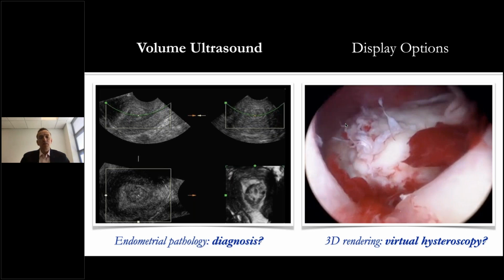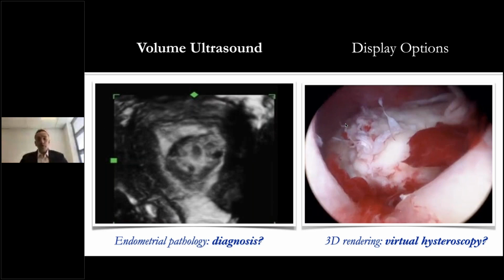So the value that you get from the ultrasound enormously impacts how I coordinate my surgery, who I get to do my surgery, if it's not me, it usually is me, and how long I would take, so I can use my operative time in a meaningful way, which is extremely important now with COVID, as I'm struggling to get my patients through. And there's the render view side by side.